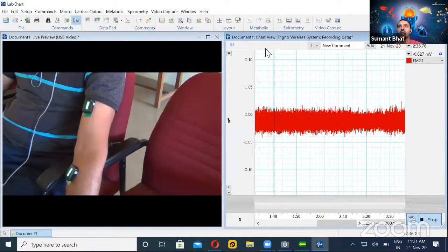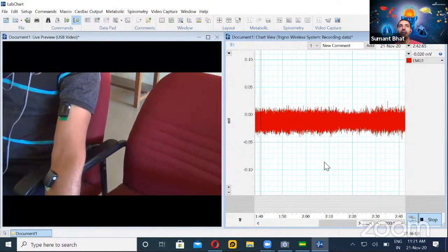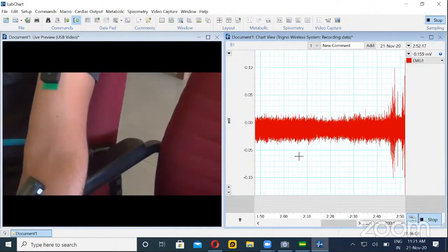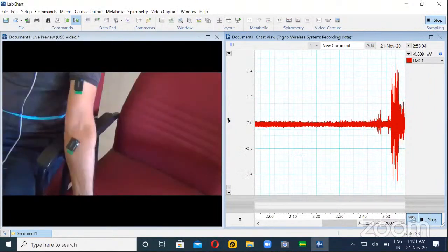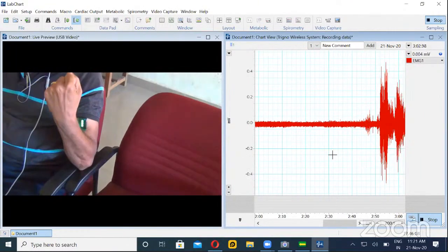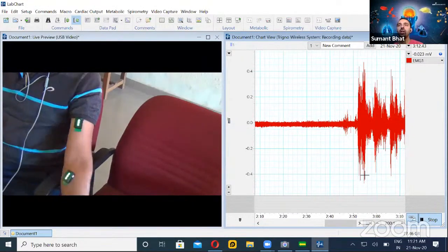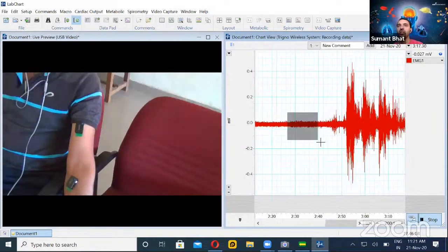Let's do a small muscle contraction and you can see an amplitude change. You can also see the video on the side, so you will have live feedback of the action and the response. I'll be doing the contraction now. So after two or three repetitions, you can appreciate the difference between the resting and the contraction phase.